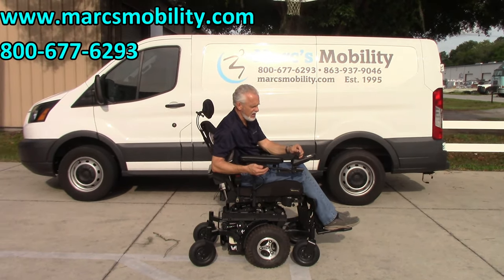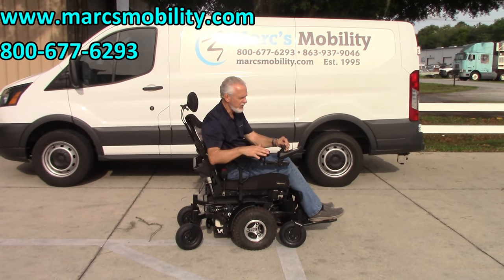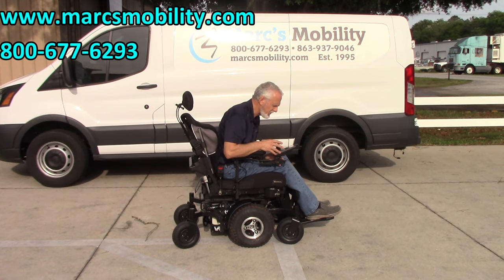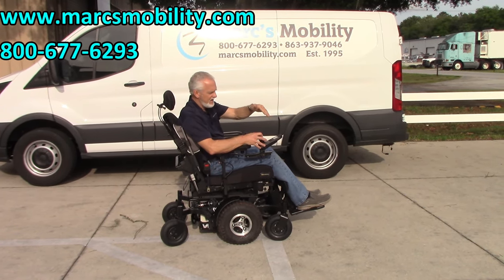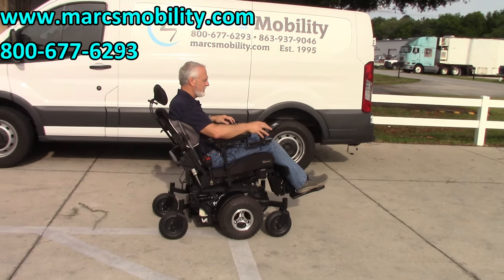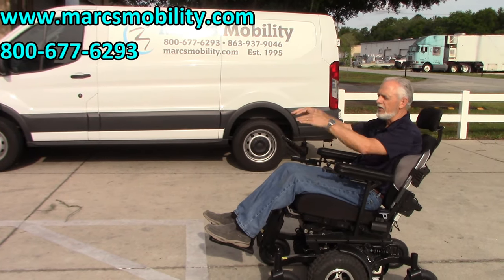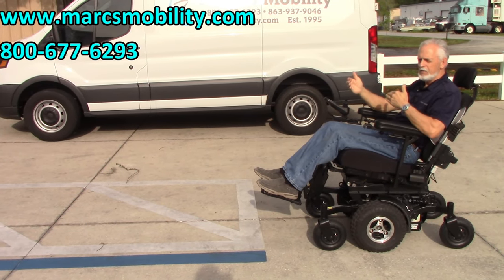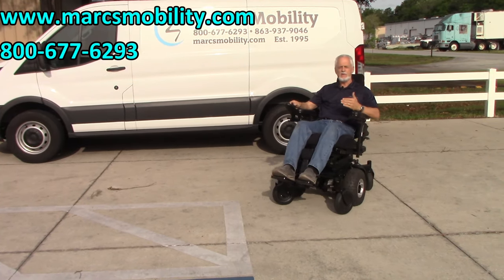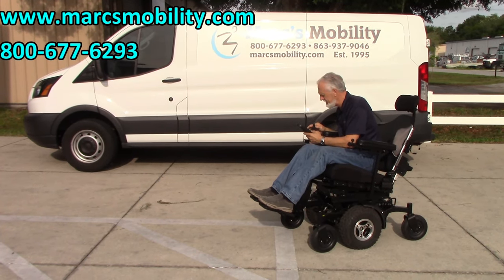Here's a tip for people using these types of chairs on hills. If you're going down a steep hill and you get nervous, what you can do is switch to the tilt mode and tilt the seat back like this, then put it back in drive. You can go down the hill almost level because you've tilted back — it won't feel like you're falling forward. The opposite applies when going uphill. Tilting also helps give you more effective power and control on slopes.